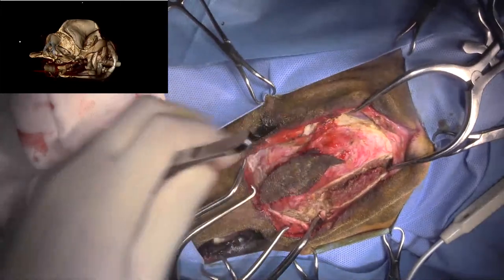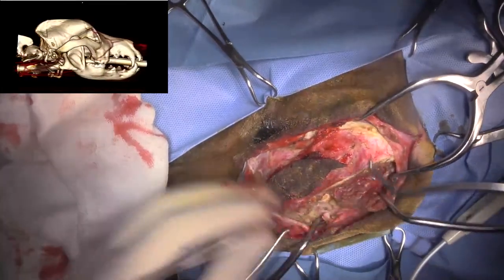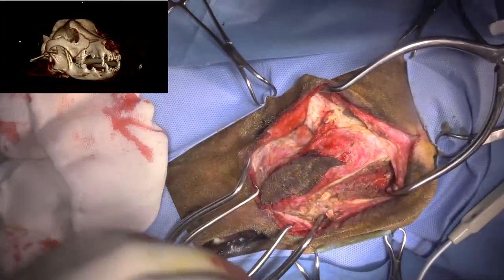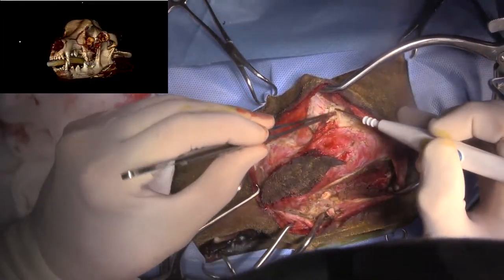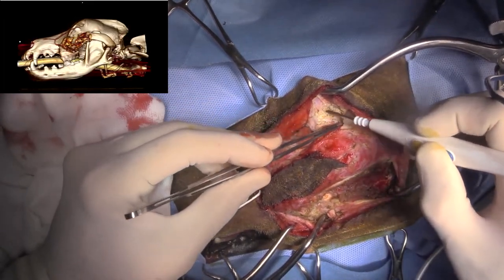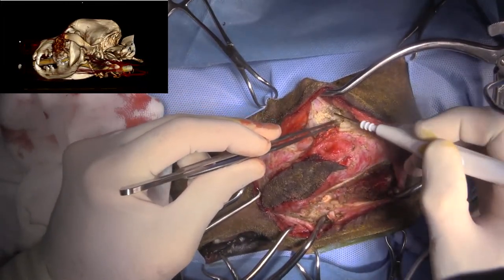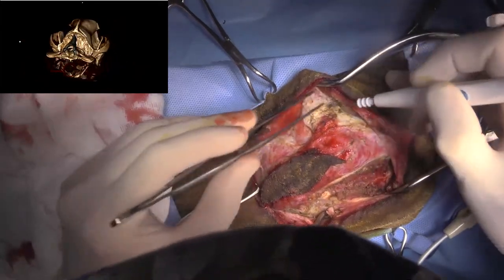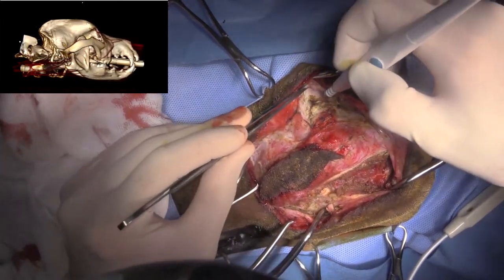So that's getting back into that zygomatic ligament. It's masseter muscle down there. So that's the zygomatic ligament that I'm cutting through right there.